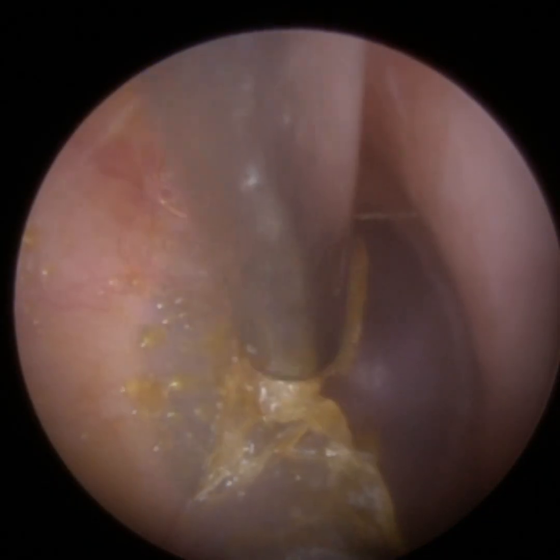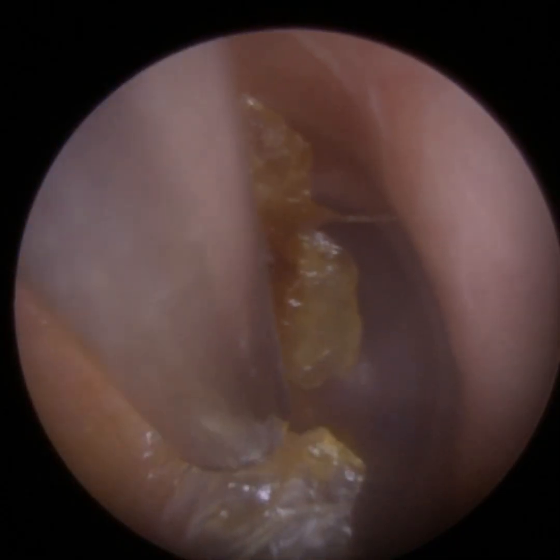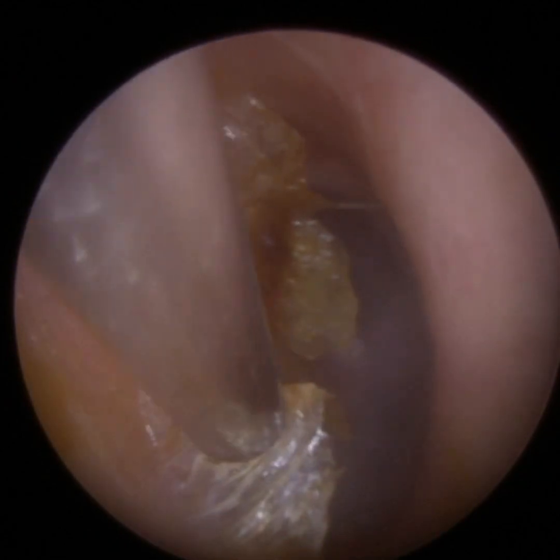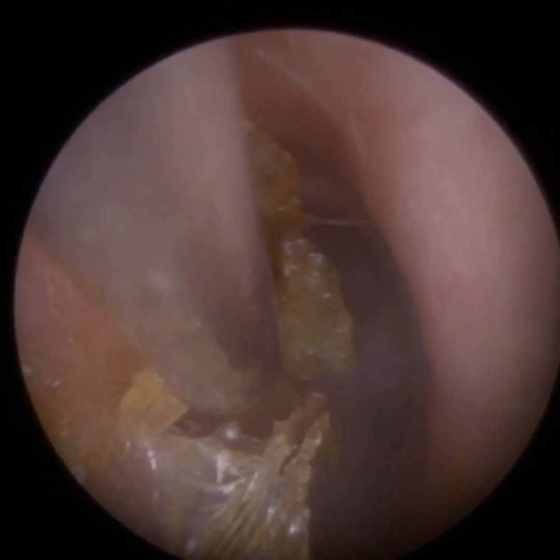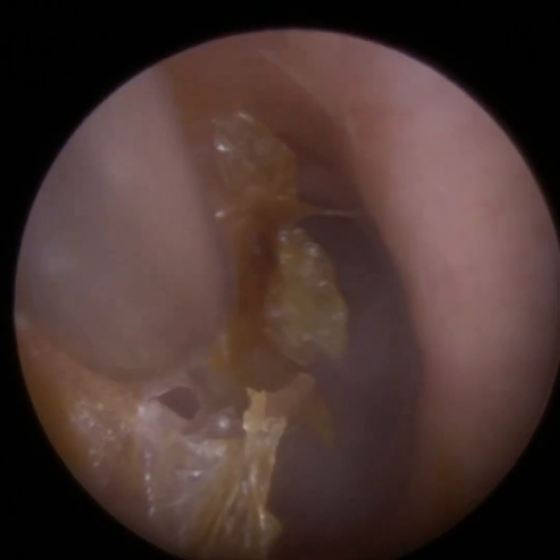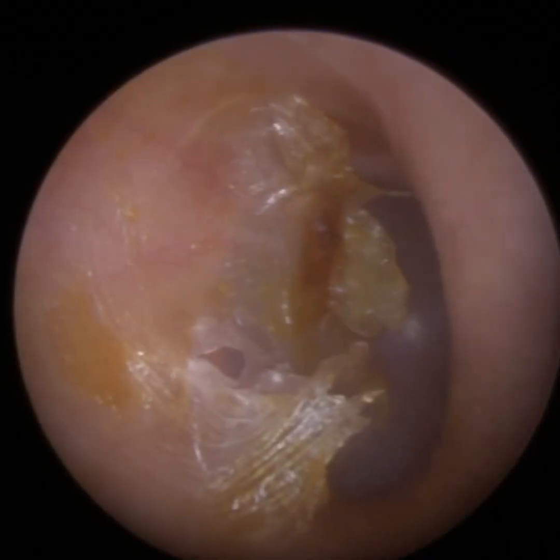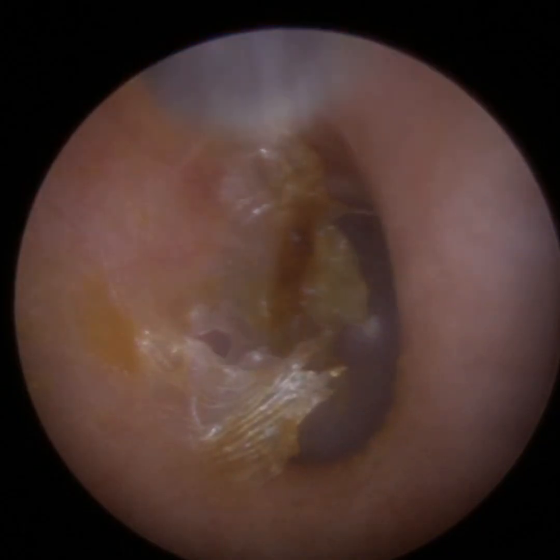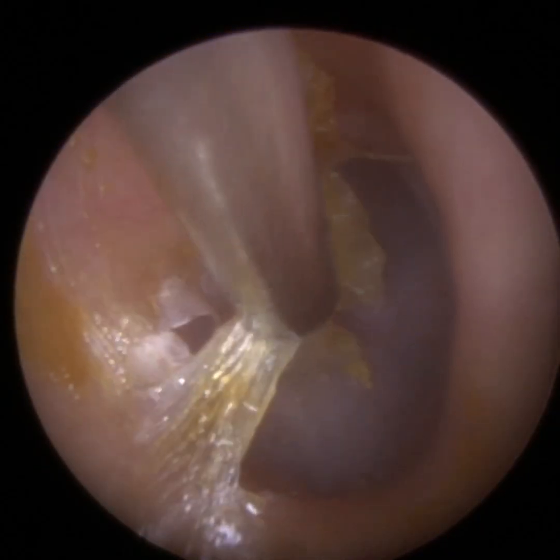But for some reason, we don't know why, the patient's in his 20s, the skin has stopped migrating. So it's dying on the eardrum, but it's remaining on the eardrum. It's not moving sideways. And in the case of the left ear, that has then led to a fungal ear infection, what we call otomycosis. Now, when we go back to the left ear in a moment, you will see that you have these fungal spores, and you get different types of fungal spores, but with this patient, the spores are almost like cotton wool fibres.